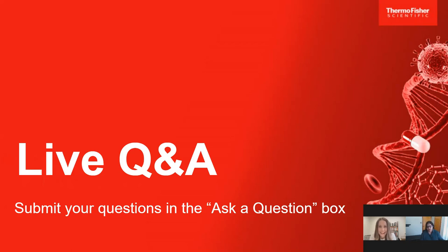Thank you, Darpan. The next question: do you have any tips on how to have successful antigen retrieval for brain slices? Which one is better, heating or enzymatic treatment? Yeah, so it depends on what you are trying to do. If you are using injured tissue, then antigen retrieval can become very harsh because you are going to lose tissue around the injury site. Like if you are using multiple sclerosis models, there is a lesion around it and you will lose the tissue, then antigen retrieval will be harsh.